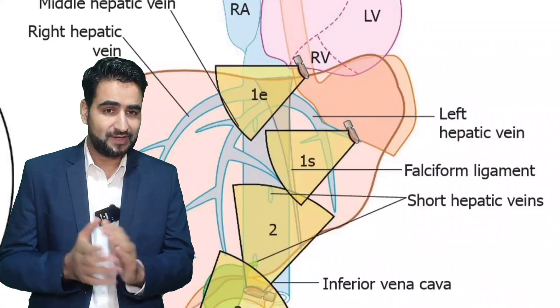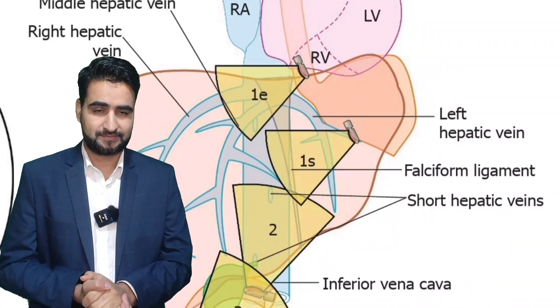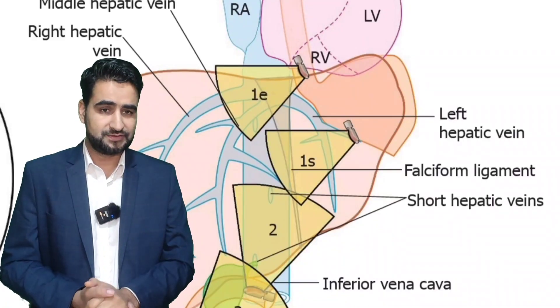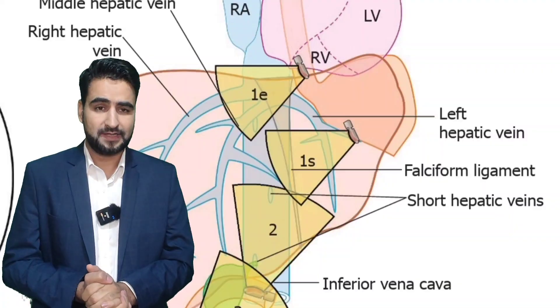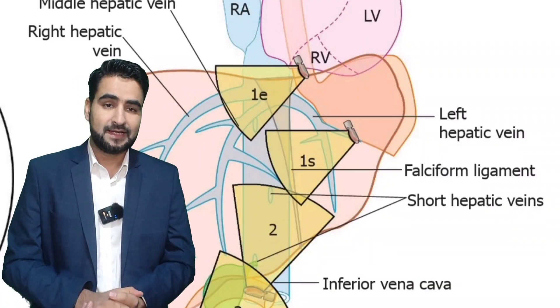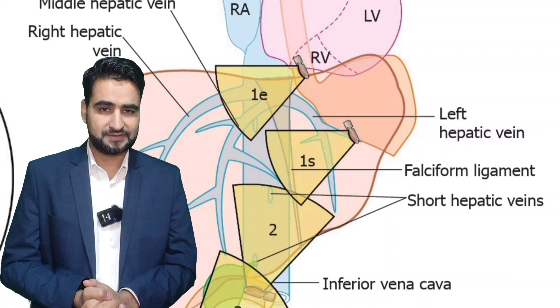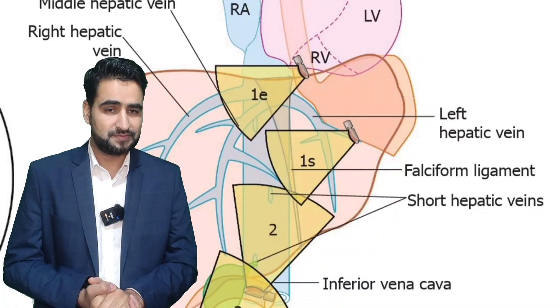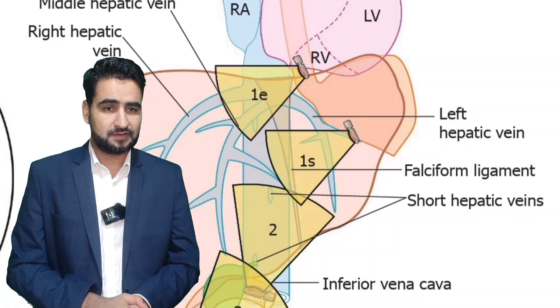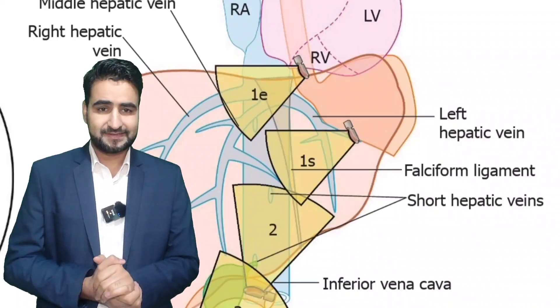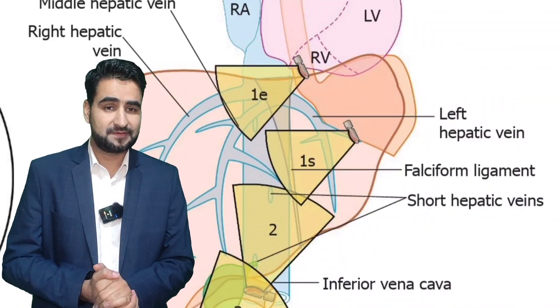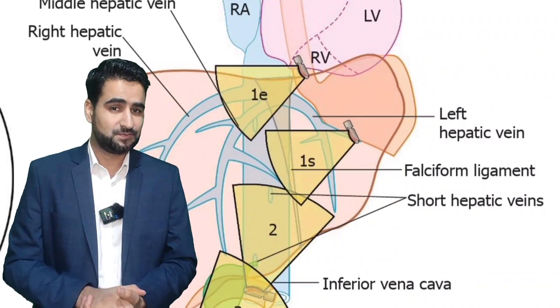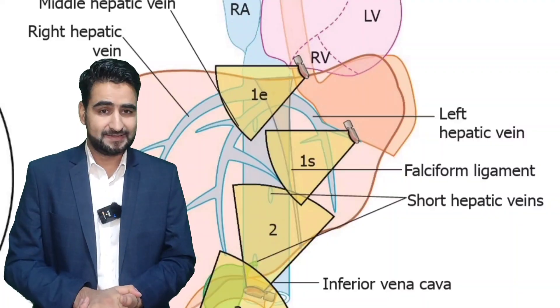Let's summarize the stepwise tracing of the portal vein from station 1. Begin with the left portal branch coursing through the transverse fissure. Rotate clockwise to find the union of the right and left portal branches — the main portal bifurcation. Appreciate the 4-centimeter breadth of the transverse fissure, the zone of branching. Use slight upward angulation to follow the right portal branch, coursing 6 to 9 o'clock beneath the caudate process. Mastering this sequential tracing is crucial for accurate segmental anatomy interpretation, identifying vascular variants, and planning interventions such as portal vein sampling, TIPS, or targeted therapy.